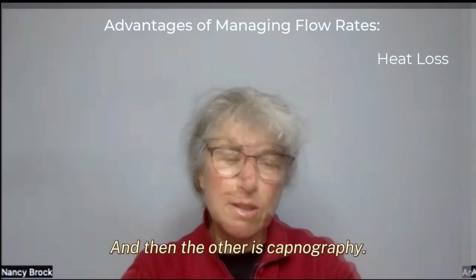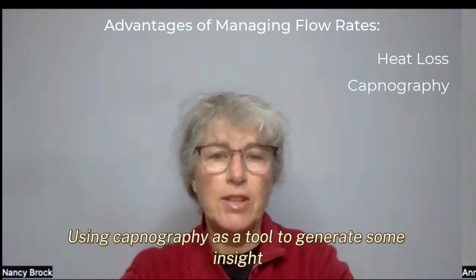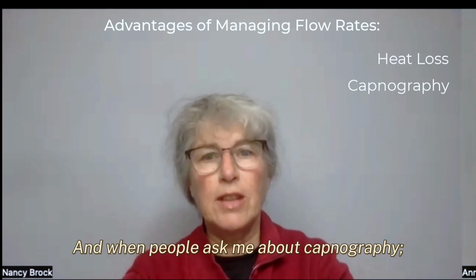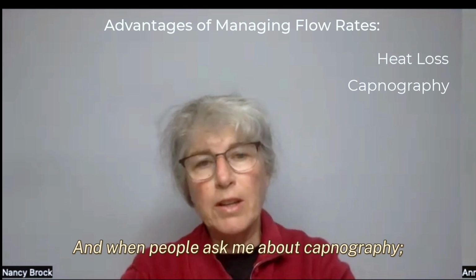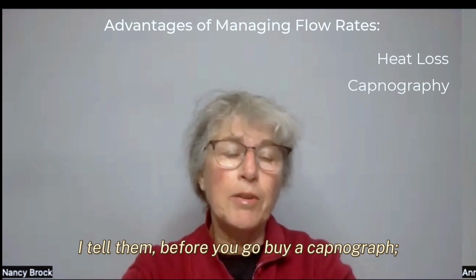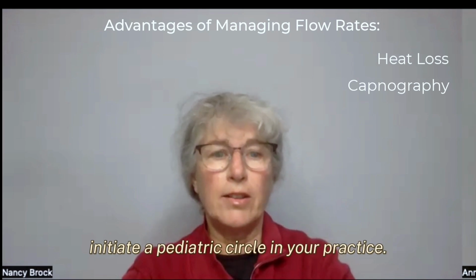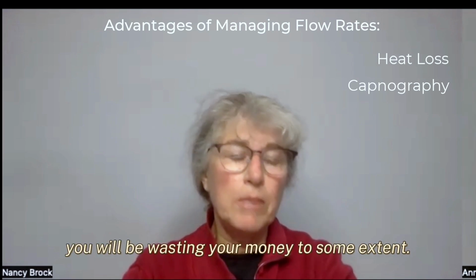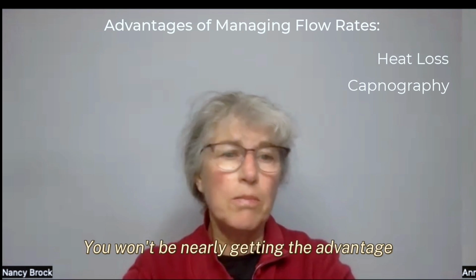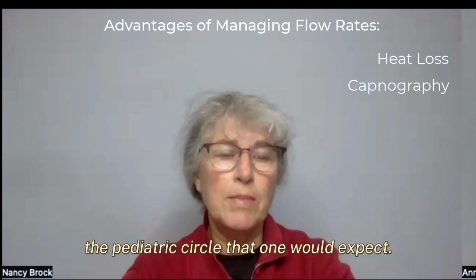And then the other is capnography, using capnography as a tool to generate some insight into what's going on with your patient. And when people ask me about capnography, I tell them, before you go buy a capnograph, initiate a Pediatric Circle in your practice, because otherwise you will be wasting your money to some extent. You won't be nearly getting the advantage of the Pediatric Circle that one would expect.